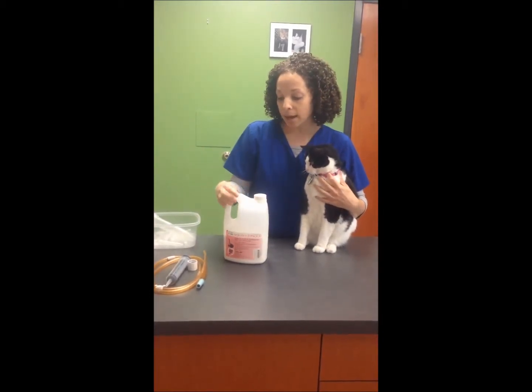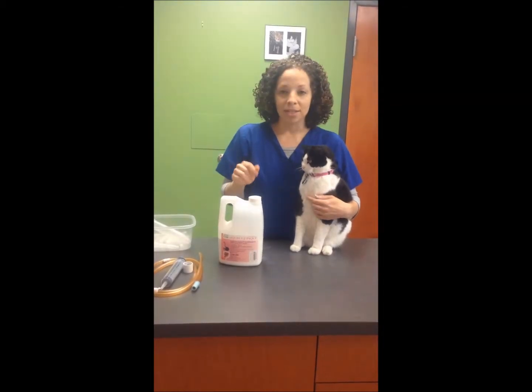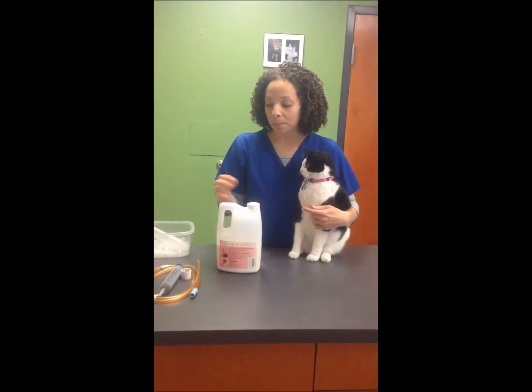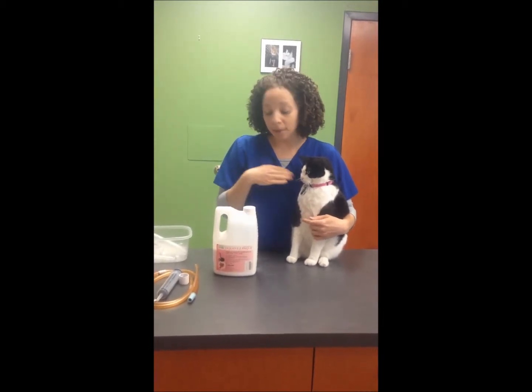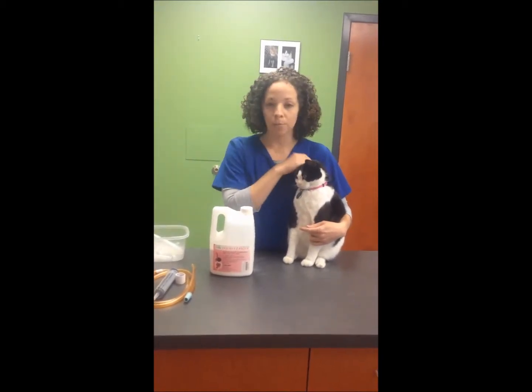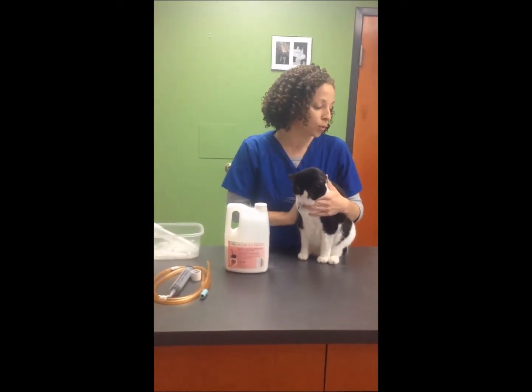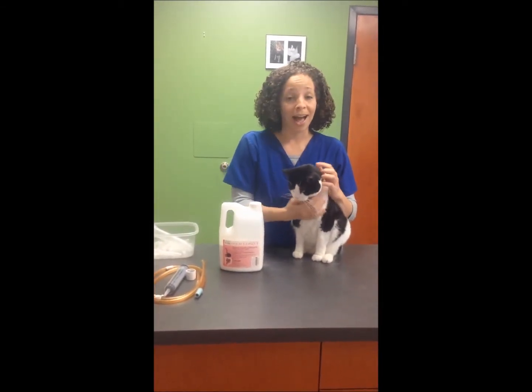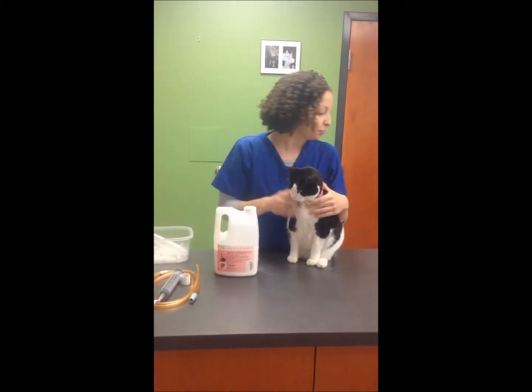It can sometimes move a little slowly throughout the GI tract, which can affect your study, but chilling it actually can help with that. If we were suspecting that Mona had a perforation or a rupture anywhere in her GI tract, we would want to use a water-soluble organic iodide instead, which would be more appropriate in that event.